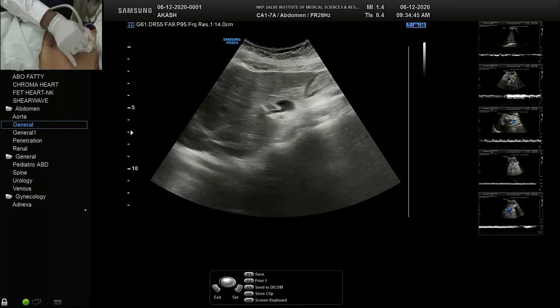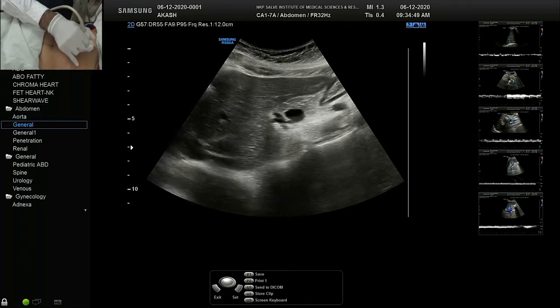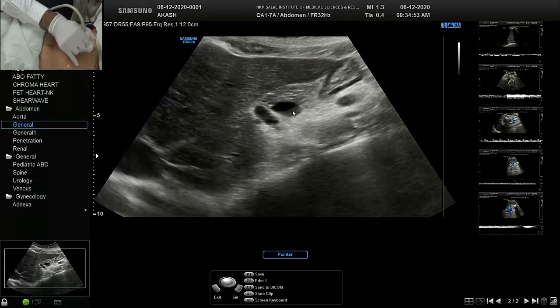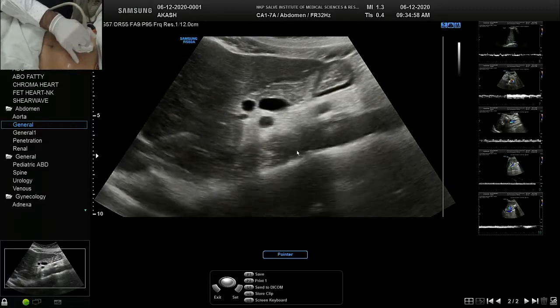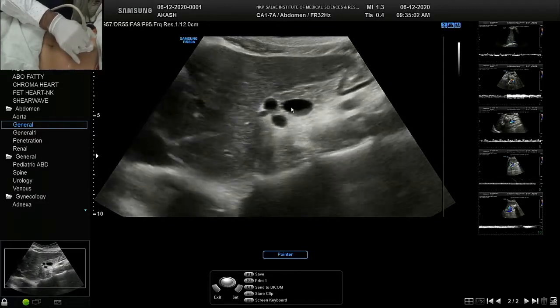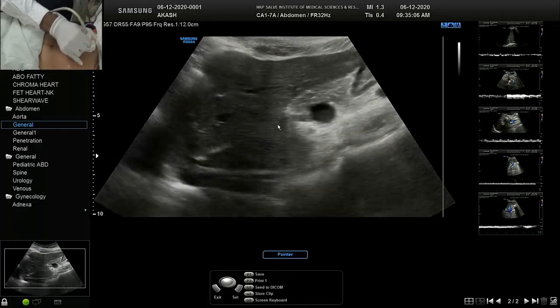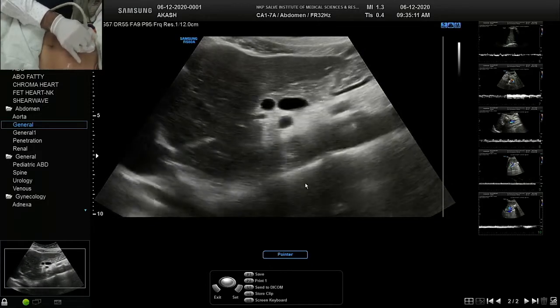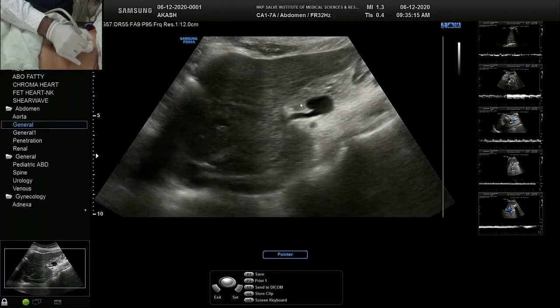That coronary vein I was talking about, it is seen here. That is the splenic vein, aorta. That is celiac trunk. This is SMA origin, and almost at the confluence we see this coronary vein. As we have seen, the caliber is 2 to 5 millimeters. We will try to see flow in that.